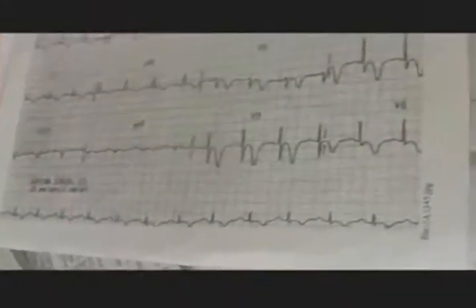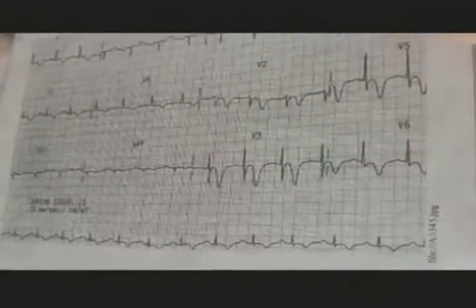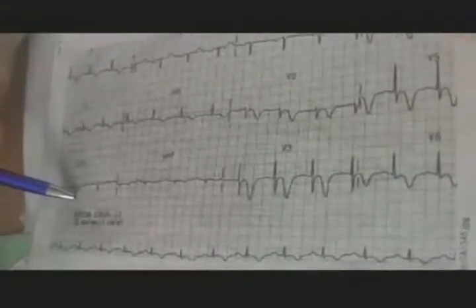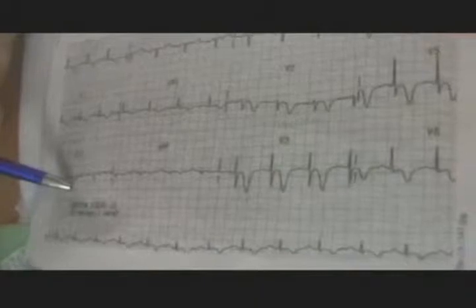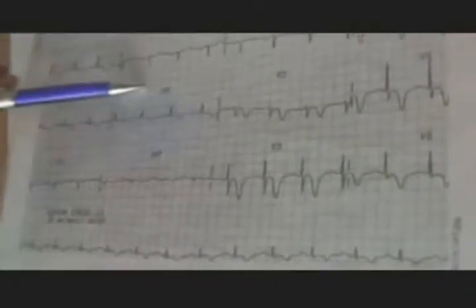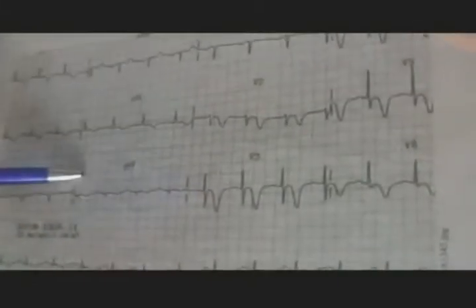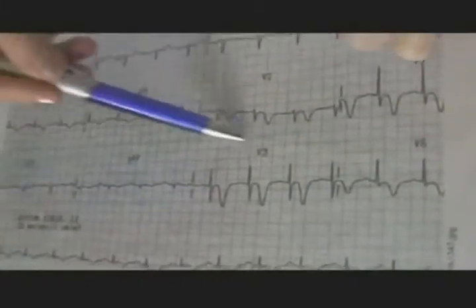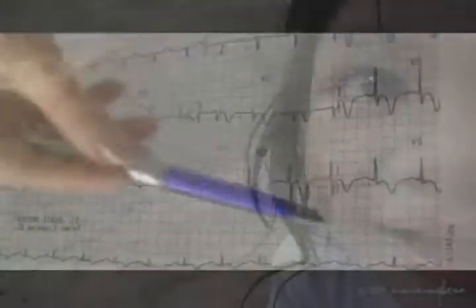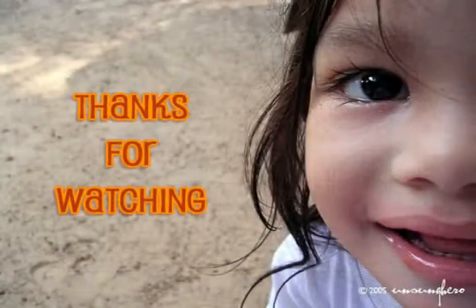And when we start interpreting the ECG, remember that every lead has definite information about heart affection. Yes? First and AVL, anterior wall; third and AVF, posterior wall; this again anterior wall, apex, interventricular septum, lateral.